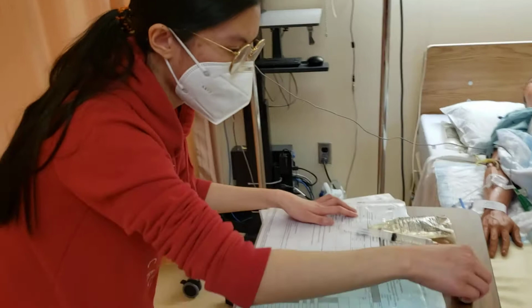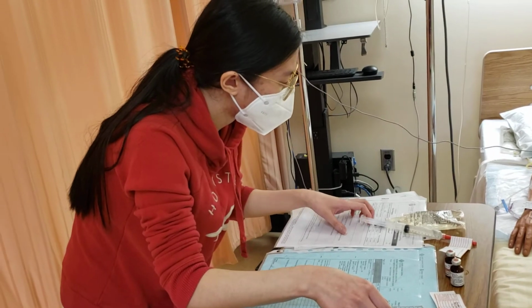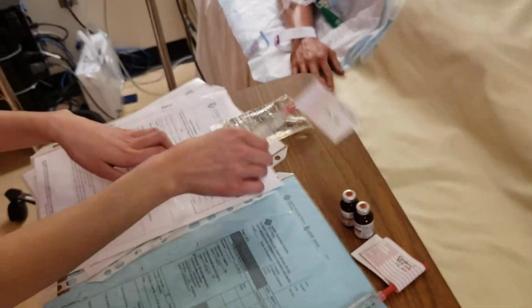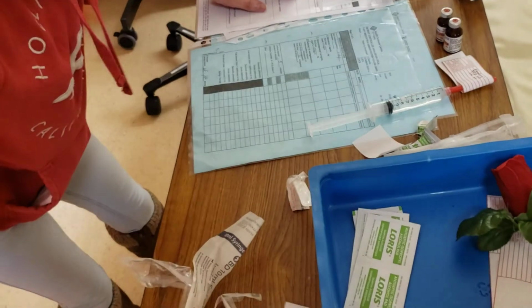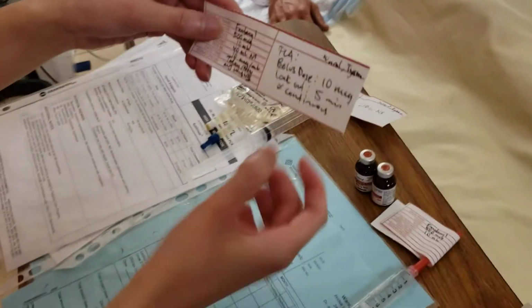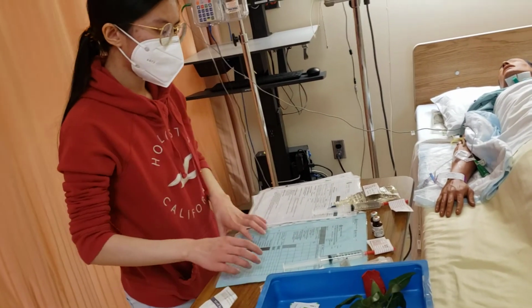So I have that fentanyl right here, and I would need about 10 cc of fentanyl. I have 10 cc right here, and I would need a diluent of 40 ml normal saline. I have 10 cc of normal saline here, which I removed from the 50 cc to get that 40 cc of normal saline. The doctor has ordered 10 micrograms, and I wrote that in my calculation. And a lockout of 5 minutes, and it's not continuous, so I would label that. It has been given today, and it has been transcribed twice, so I could give this medication.